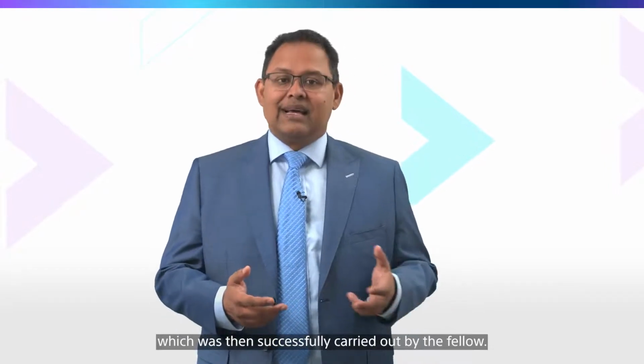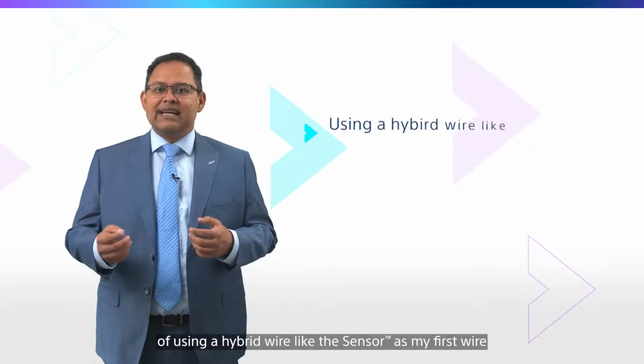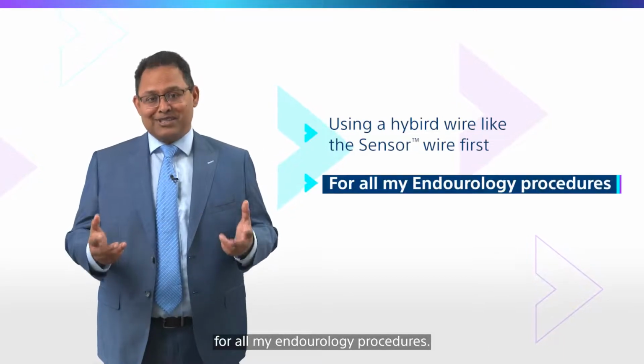I then explained my rationale to our new fellow for using a hybrid wire like the sensor as my first wire for all my endourology procedures.